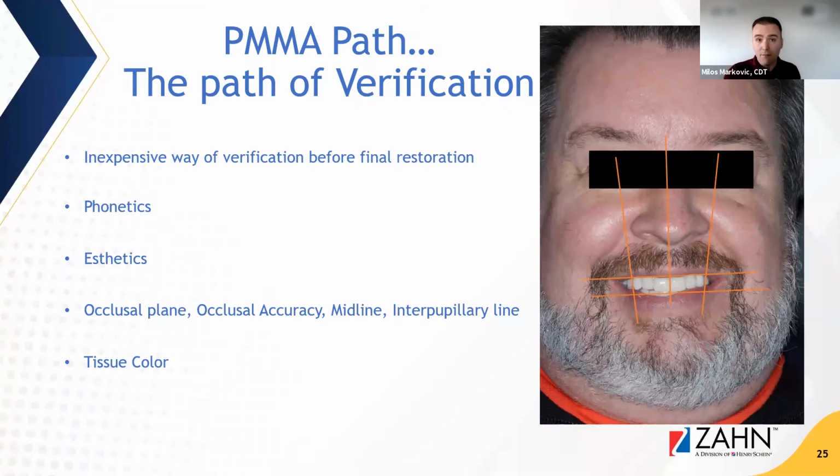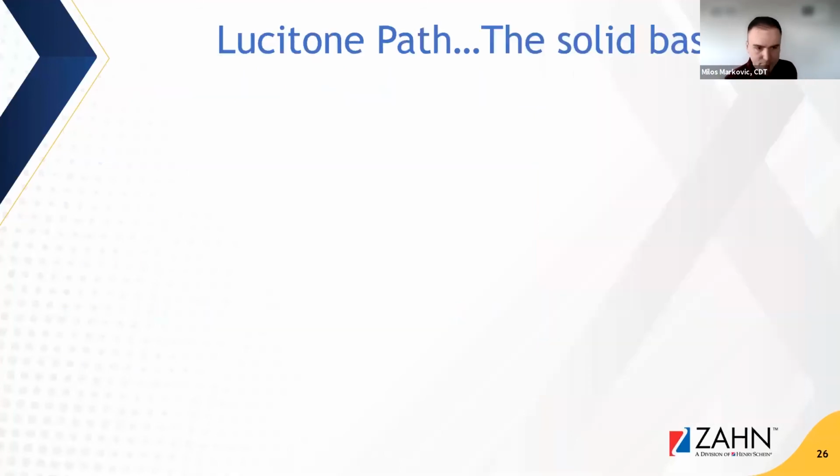But pictures and PMMA, right on. It's the best way to save yourself time and money, and the dentist as well, and the headache of going straight to zirconia and trying to work your way backwards.